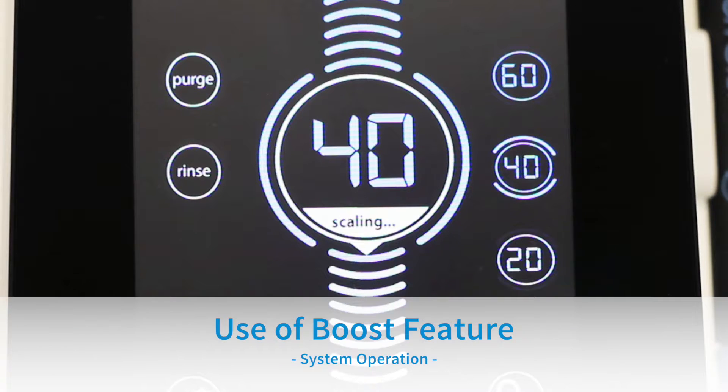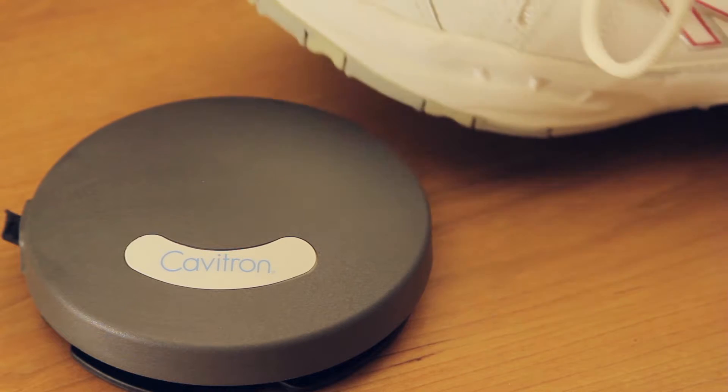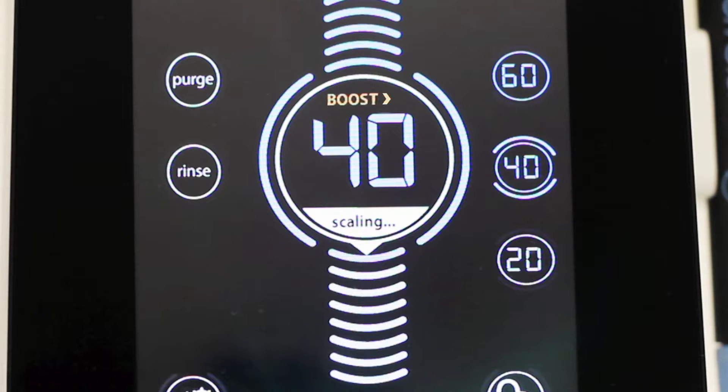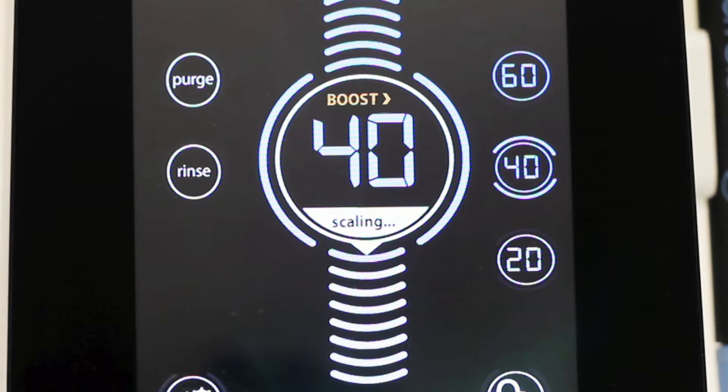Use of Boost Feature: The boost feature provides a temporary increase in ultrasonic scaling power for quick removal of tenacious calculus without actually touching the unit. Boost is activated by fully depressing the tap-on foot pedal to the second position. When boost is activated, the boost icon will illuminate on the power level bubble. Boost will remain on as long as the clinician has the foot pedal pressed all the way down. To deactivate boost, release the tap-on foot pedal to the first position.